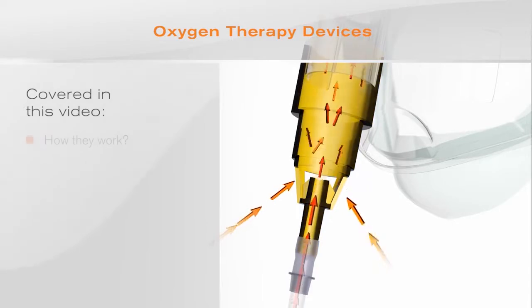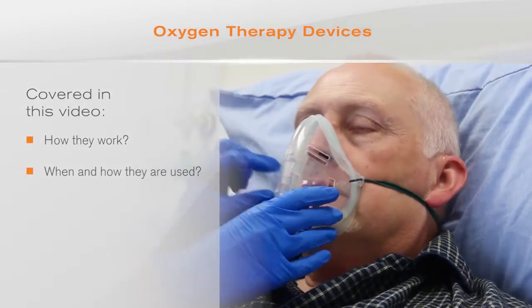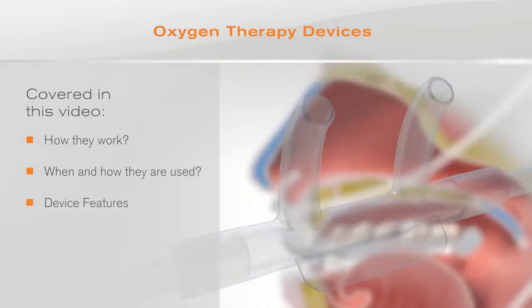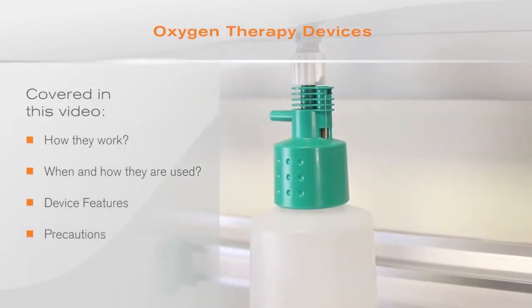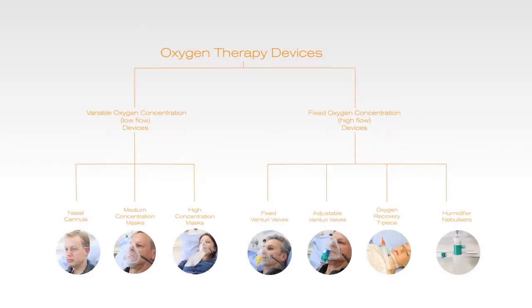We can now look at how these devices work, when and how they are used, features of the devices, and precautions associated with their use. We hope this will increase the level of knowledge in this important discipline.